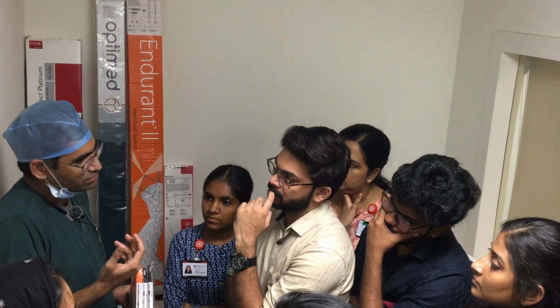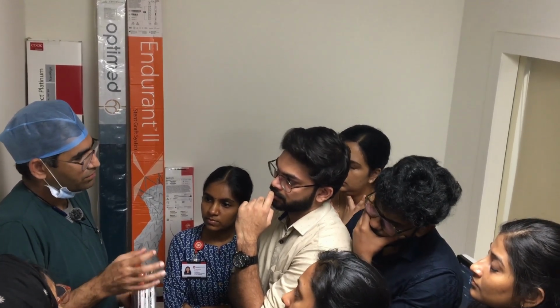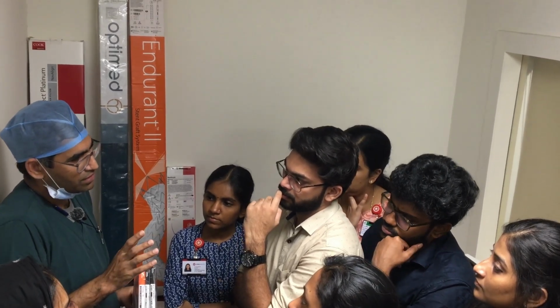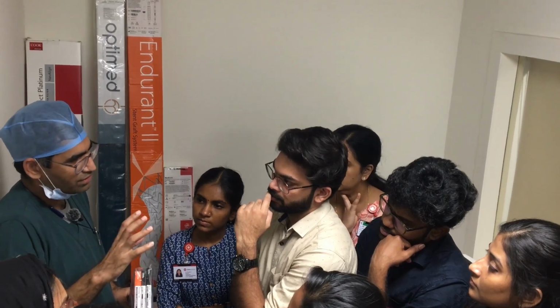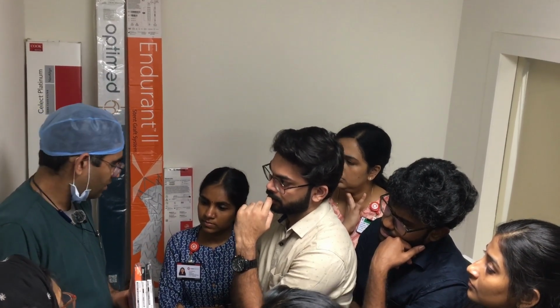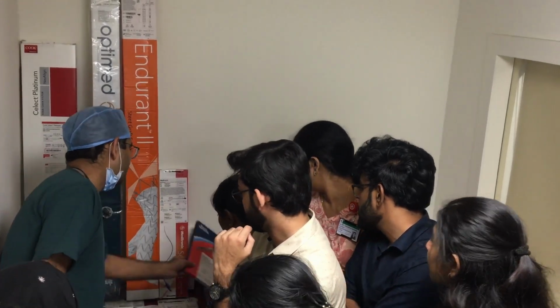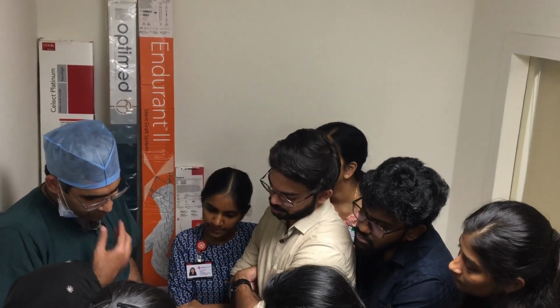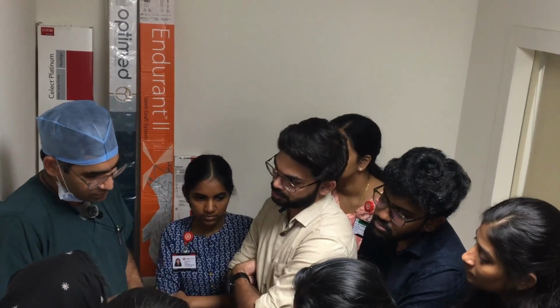What I personally use, if there is stenosis, is the softest wire, so it will not produce any injury to the plaque. It will just find its way through the true lumen and come out the other side. Once we have a wire across, the next step is to dilate with a balloon. So if you have a balloon, then it will dilate the plaque or lesion.